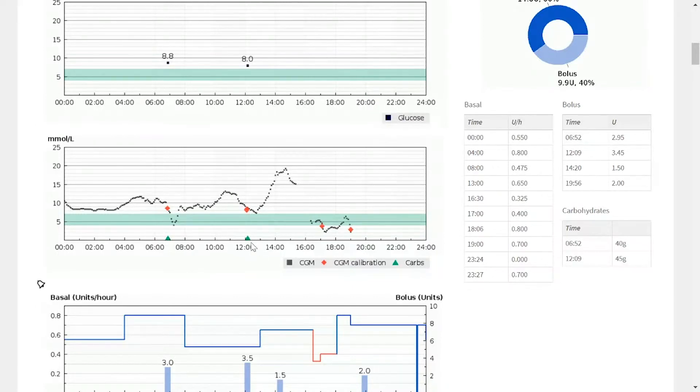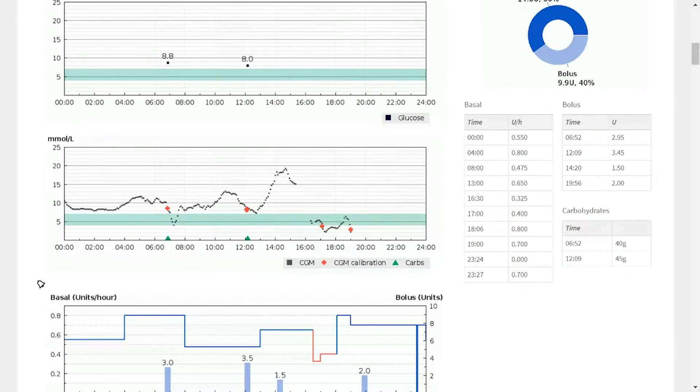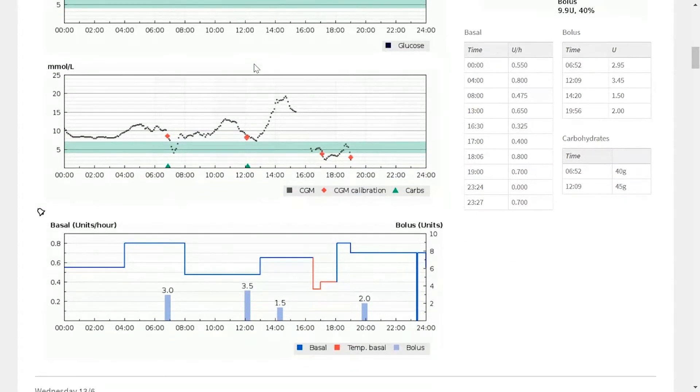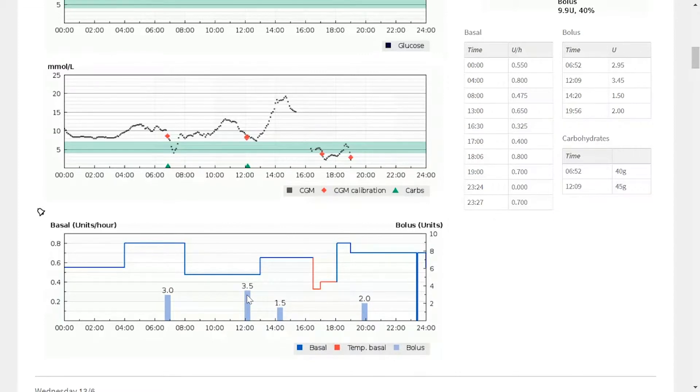When we get to just past 12 o'clock, the patient had carbs again, in this case 45 grams as we see on the right hand side. This coincided with a blood sugar of 8 exactly. And the patient decided to give a 3.5 unit bolus.